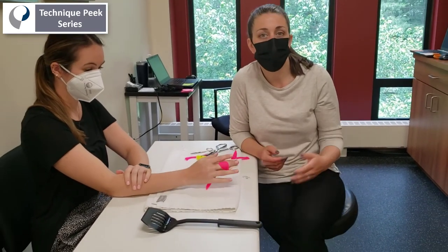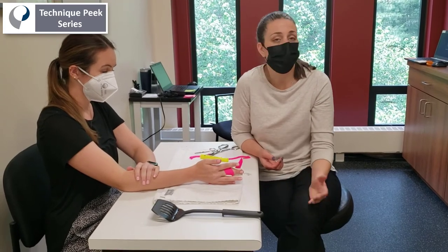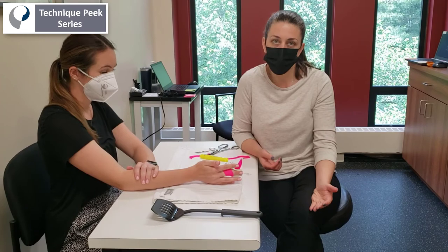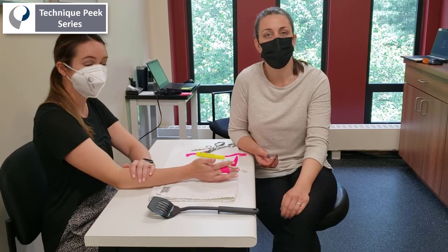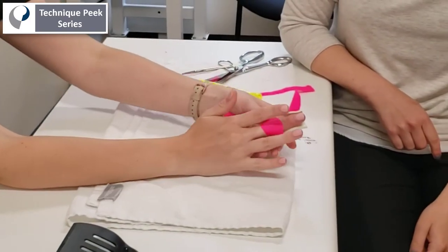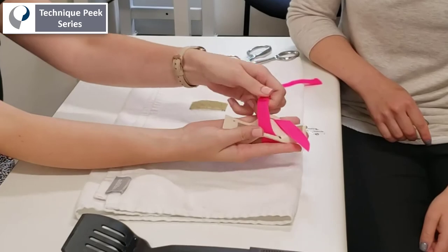Once you've tested with the patient that there's no irritation and you've educated them in checking their skin and fingertip for signs of decreased circulation, you can instruct them to build up to five to 15 minute sessions three times a day to achieve maximal gains in PIP joint extension. And once you get to 10 or 15 degrees you can switch to other methods like serial casting, which works better for PIP joint contractures less than 10 degrees. Thanks for tuning in!